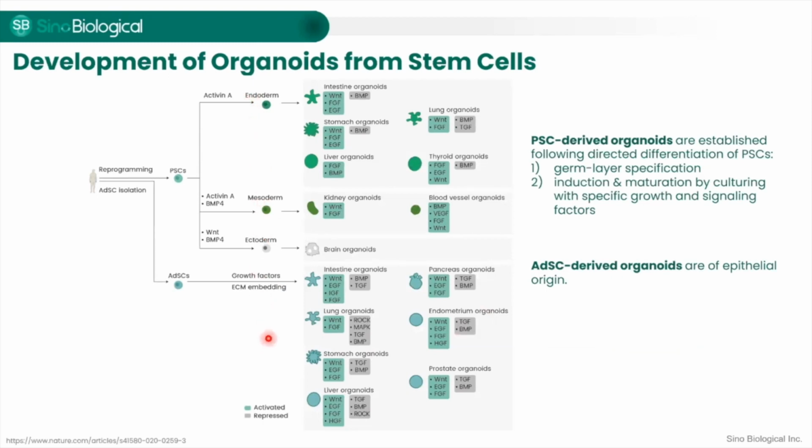And organoids can be derived from embryonic stem cells, adult induced pluripotent stem cells, or primary tissue. Different media components are required for each of these types of source cells used and the type of differentiation to be achieved. And there are growth factors that are essential components of organoid culture.